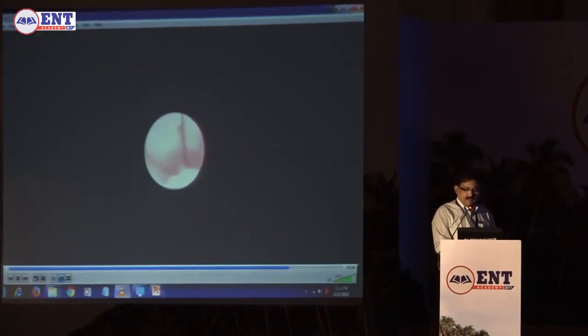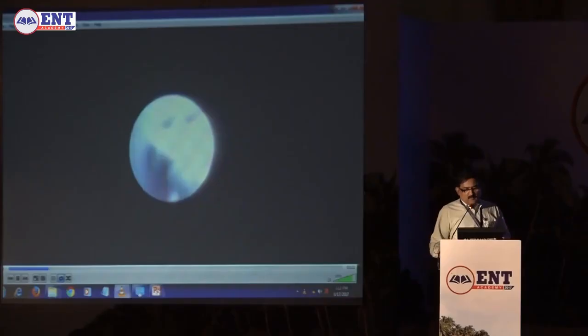I think the full video is not here. This is a patient who had an unindicated open surgery on the parotid duct. We had to really struggle to recannulate the duct, take out the stone, put a stent, and to top it all, the family just can't afford any payment. So sometimes it's very difficult to do these kinds of things in non-paying patients, but someone has to do it. Being an 18-year-old girl, somebody has to help her, so we did that. Now that problem has been settled, but it took almost 3 scopies to do this.